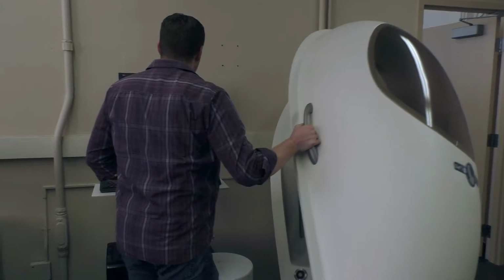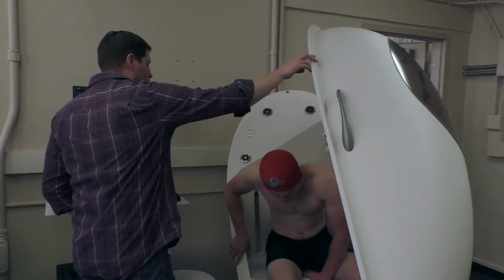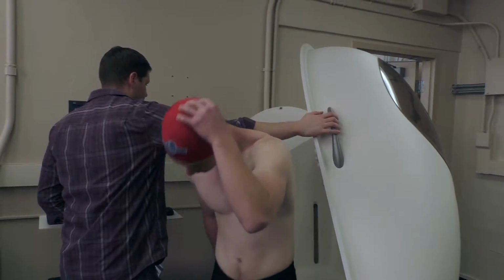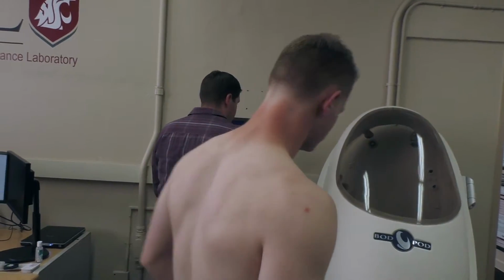Okay, we are done with the test, and it appears that the results are close enough between the 2 tests, so good sir, you are finished. And that concludes our bod pod test.